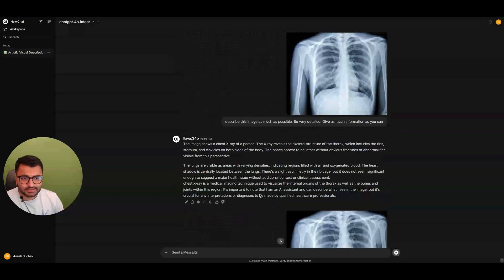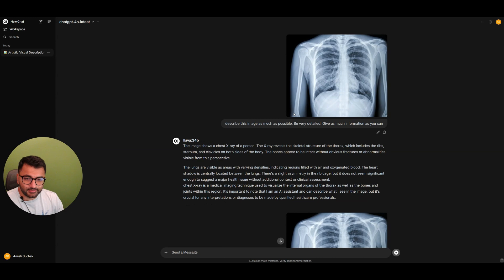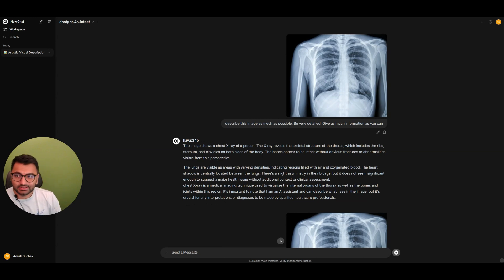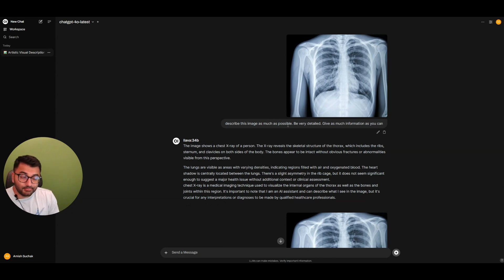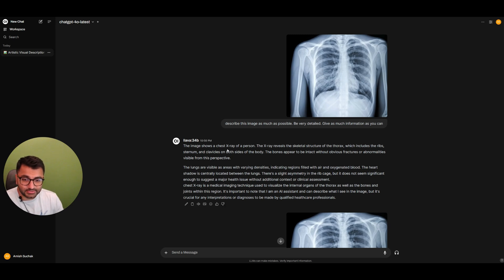I'm sure that if we did some more prompt refinement or even understood how the Lava model is trained, maybe we could even get some sort of a detailed response from this model as well.